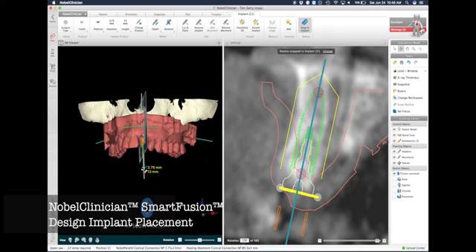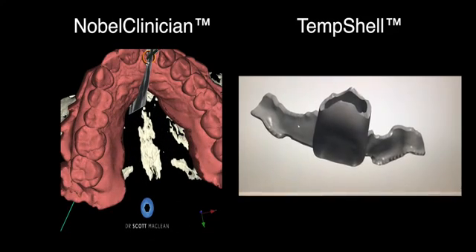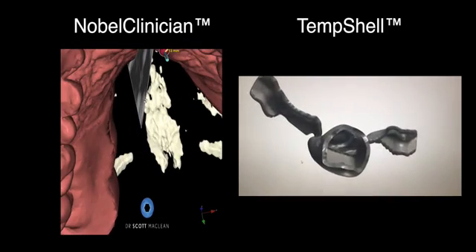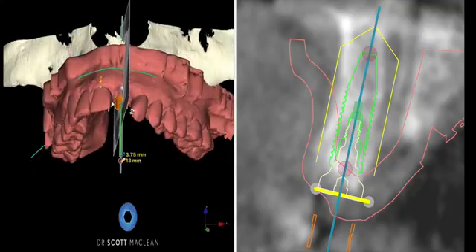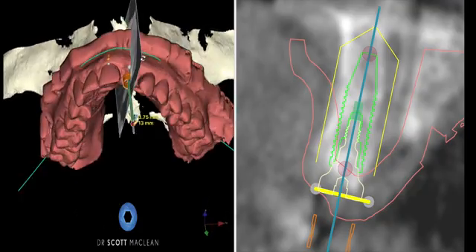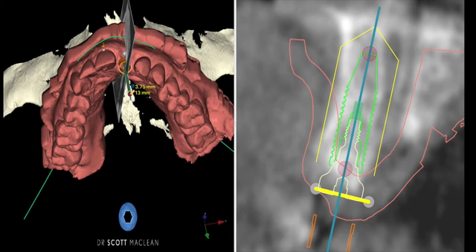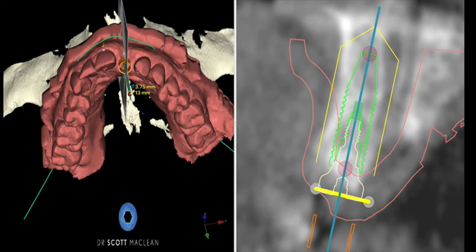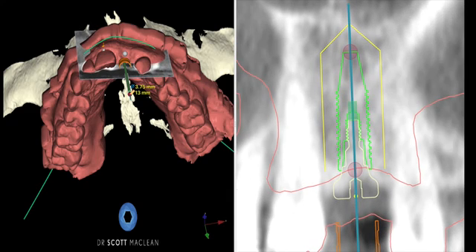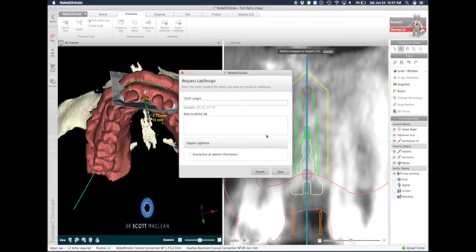We're going to use Nobel Clinician to generate what's called a temp shell. The temp shell is going to be placed at the time of implant placement. We're going to place a very tight placement — looking at the lingual aspect, it's very tight with this canal, and the buccal plate on the other side is very thin.